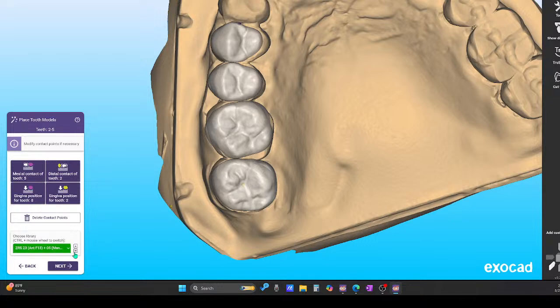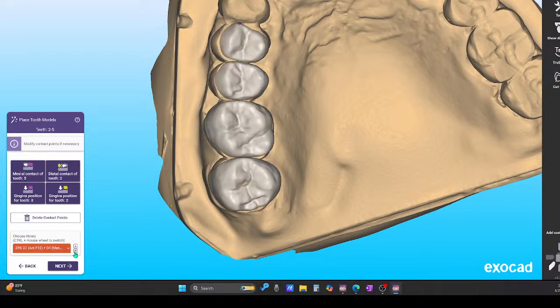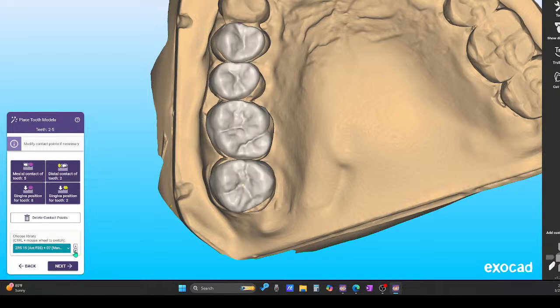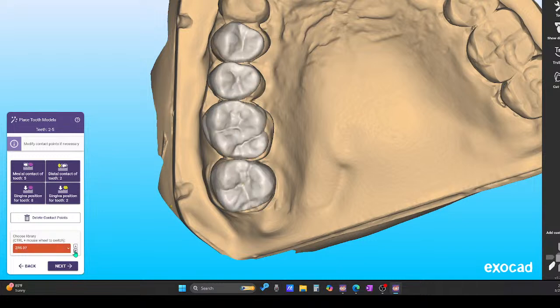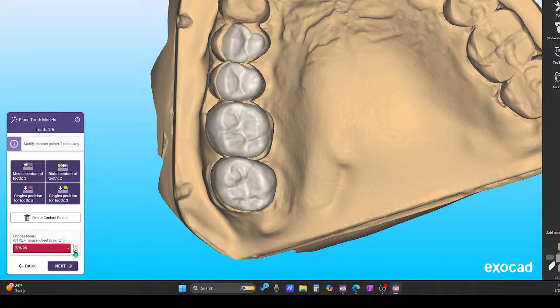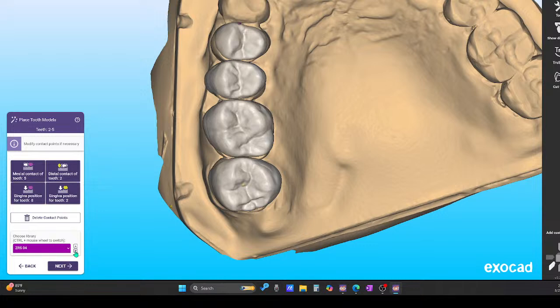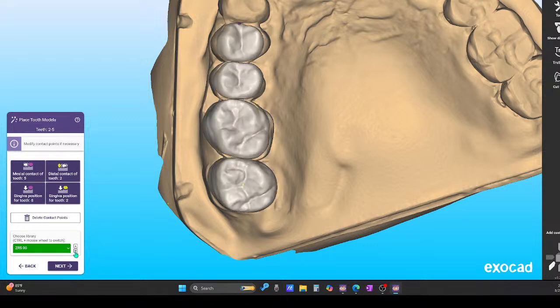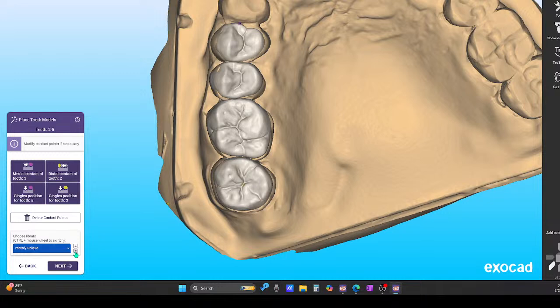Let's see. And again, if you want me to make a specific video of this, like more streamlined, I could do that. I'm just going through and showing you all how to do this. Which one covers most of the teeth in your so-called prep? I kind of like this one because it covers this good, this good, this good. This one I have to make slight adjustments, so maybe I might work with this one.